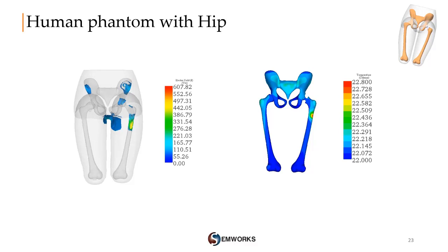Finally, when we use the human body part with the skeleton, we can clearly notice that the temperature increase is lower than the previous tests. This could be related to many reasons. One of them is that the bone conductivity is lower than the phantom. So it is important to mention that the use of a heterogeneous human body model with all main tissue materials could reveal what will occur inside a human body during MRI, which is possible to be done using HFWorks simulation.